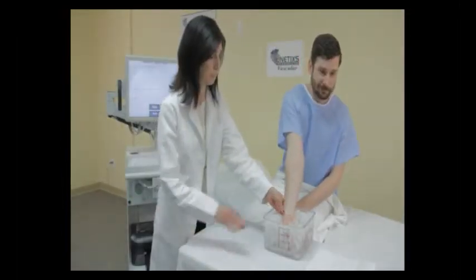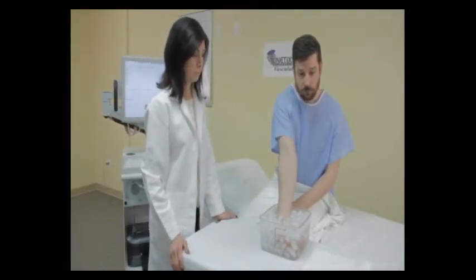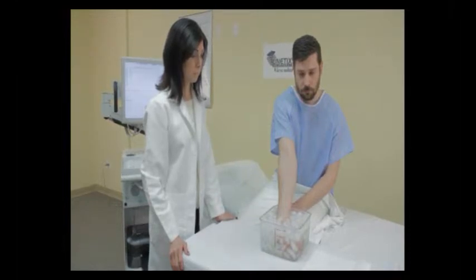Then take the patient's hand and immerse it in the ice water bath fully up to the wrist. Typically this is done using both hands, but for studio reasons we're demonstrating this on the patient's right hand only.